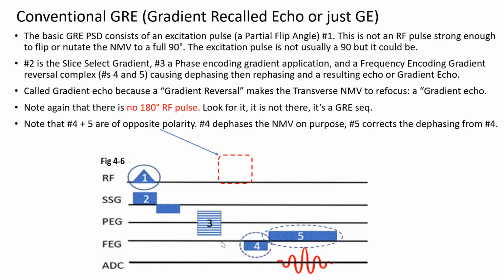And then after you phase encode, you're going to frequency encode. You're going to turn on your gradient to frequency encode that echo. That's why it's called read. So the frequency encoding gradient is on during the echo formation, also called read. So you're going to apply that frequency encoding gradient and measure the frequencies during that echo formation.